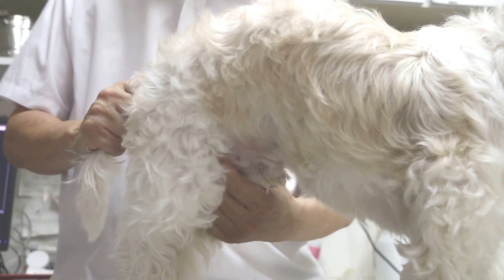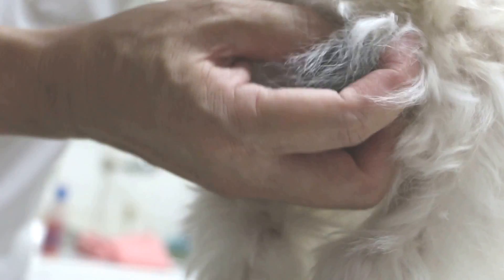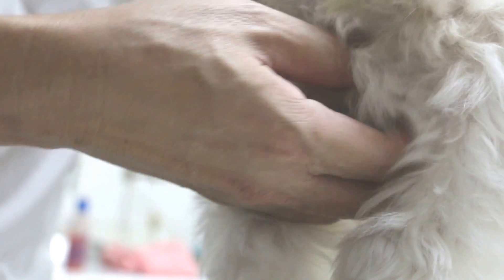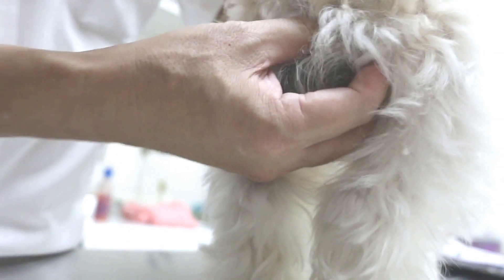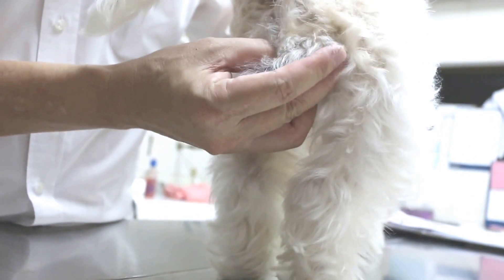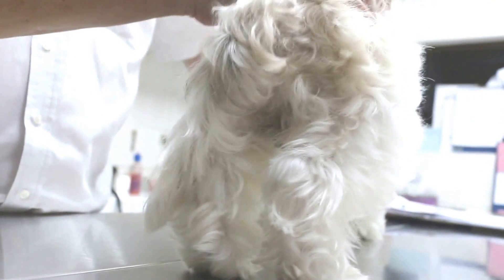That lump could be the prostate. Now because the dog is not neutered — as you can see — you can check whether a dog is neutered or not. But you have to check physically, because sometimes you can still see the scrotal sac but of course nothing inside. So it's not neutered. Now we go to the X-ray.